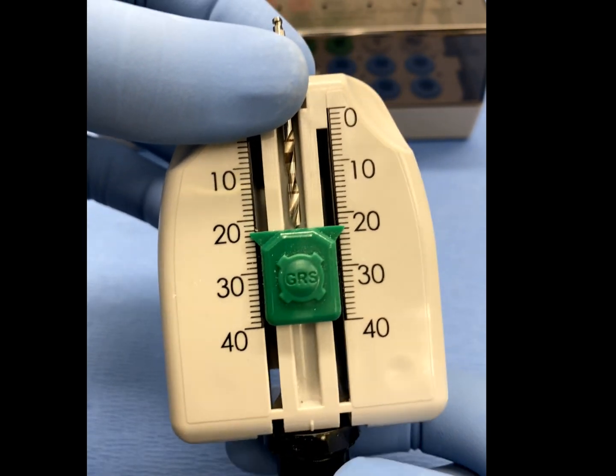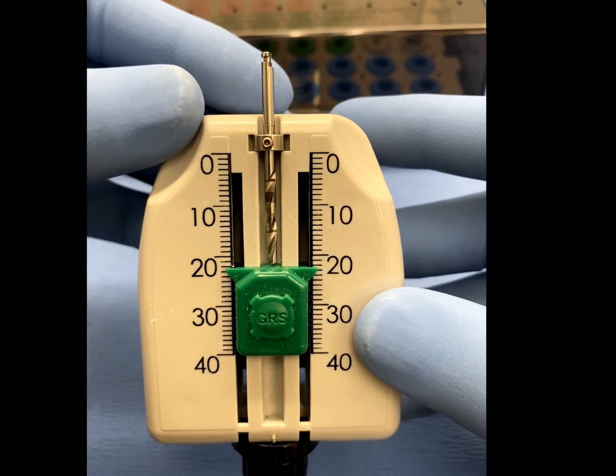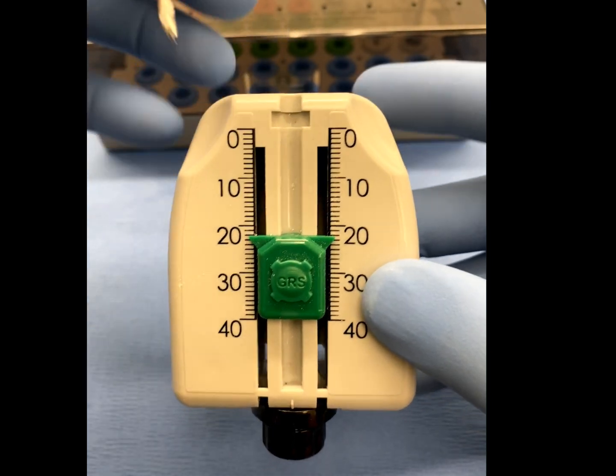Then rotate the knob located on the GRS depth gauge. The adjustable slider will then travel to lightly engage the tip of the drill.